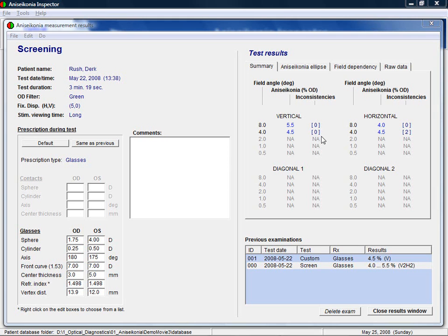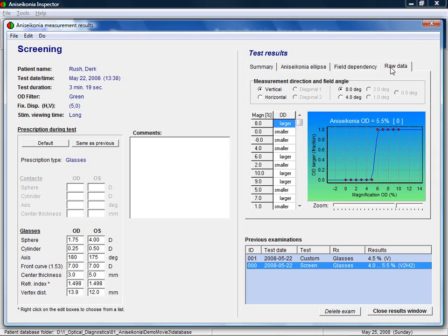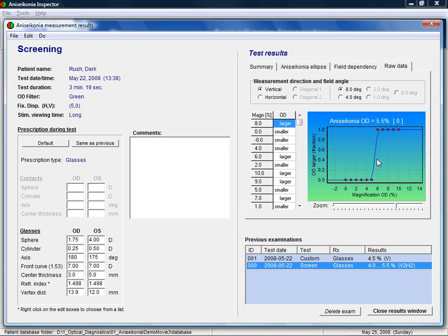Let's look at some of the raw data from this examination. Here you see a completely consistent measurement. For these image size differences, the left eye perceived the larger image. Then there is a sharp transition, giving the amount of aniseikonia, and then the right eye perceived the larger image.